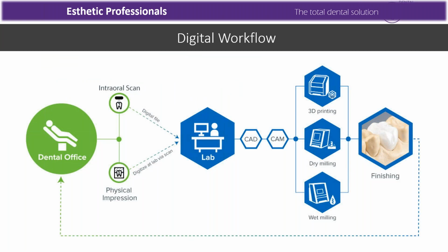Getting started, this is a workflow that I really enjoy using. It's basically the outline from beginning to end that we're all very familiar with. Everything usually starts at a dental office. You either go through an intraoral scan or a physical impression. Then you go to the lab, they do the design, they go into the CAM, and the manufacturing is either printing, dry milling, or wet milling, eventually finishing the restoration, then back to the chair for the patient.